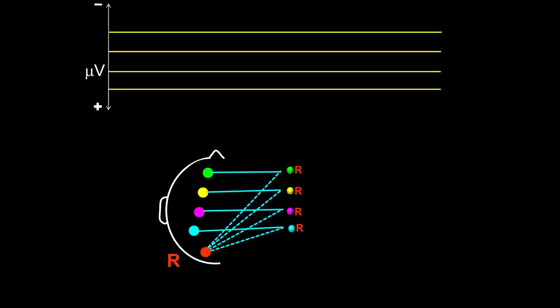In this frame, I am introducing a polarity graph. I will explain it again to make sure we are on the same page. The vertical line, the double-headed arrow by the side of the microvolt abbreviation, has a negative sign at the top and a positive sign at the bottom. It indicates polarity.